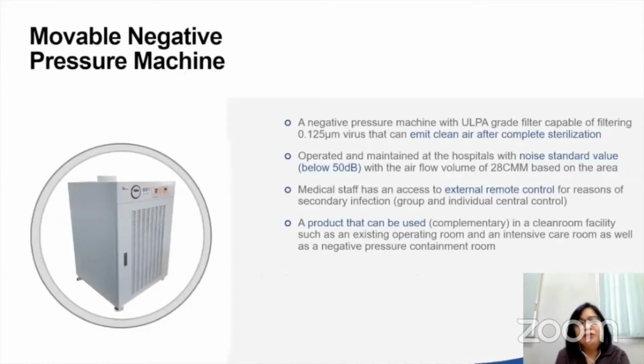There is now an available movable or portable negative pressure machine. So why do we say that this is a very good equipment? Setting up a negative pressure room is expensive. So if you have a movable or portable negative pressure machine, that will guarantee you can generate negative pressure in each room, and you can move it from one room to the other depending on where you're going to use it.